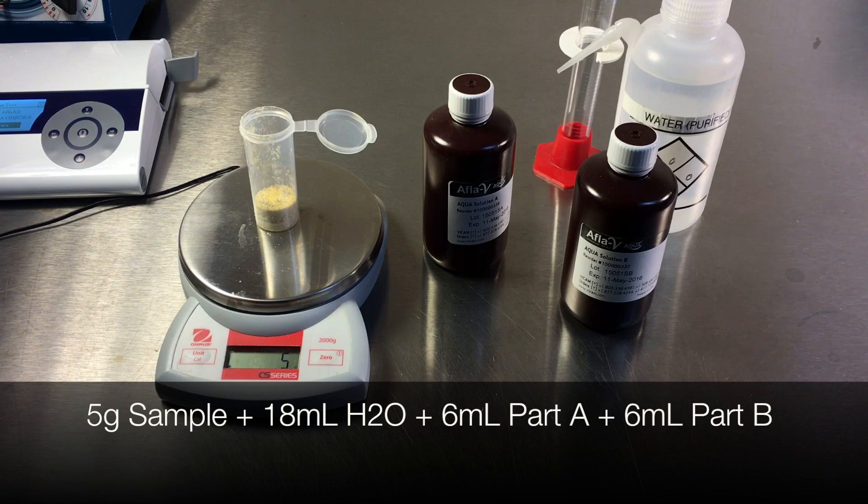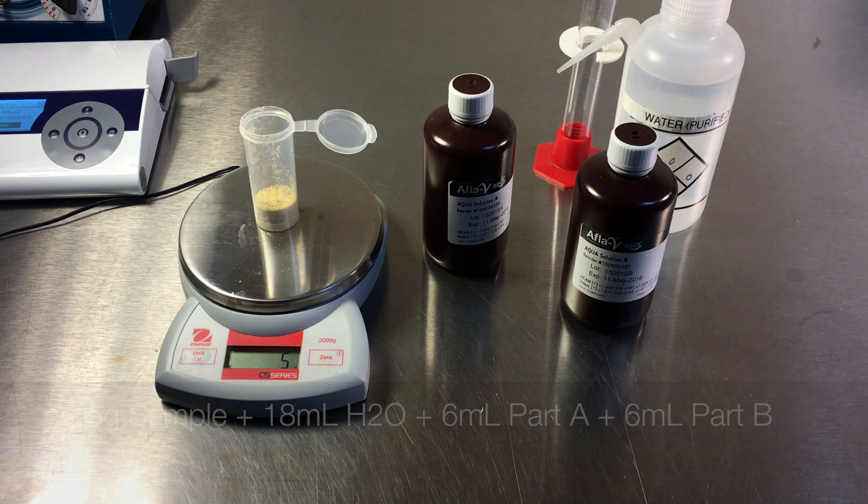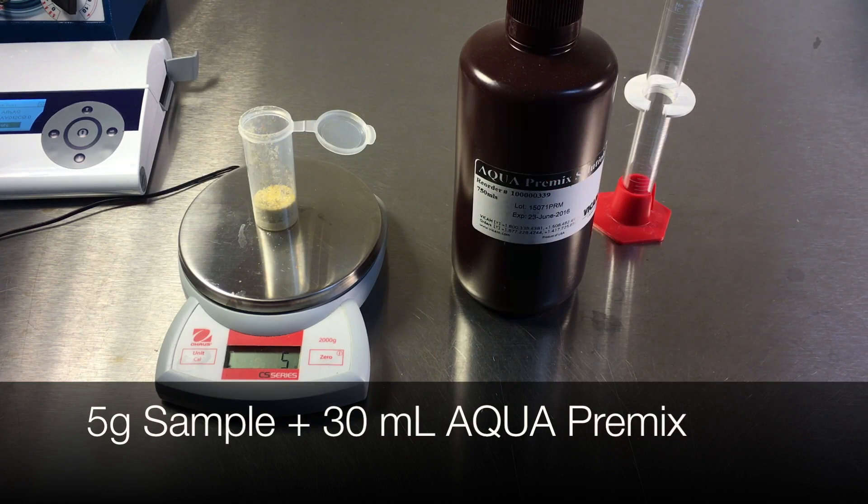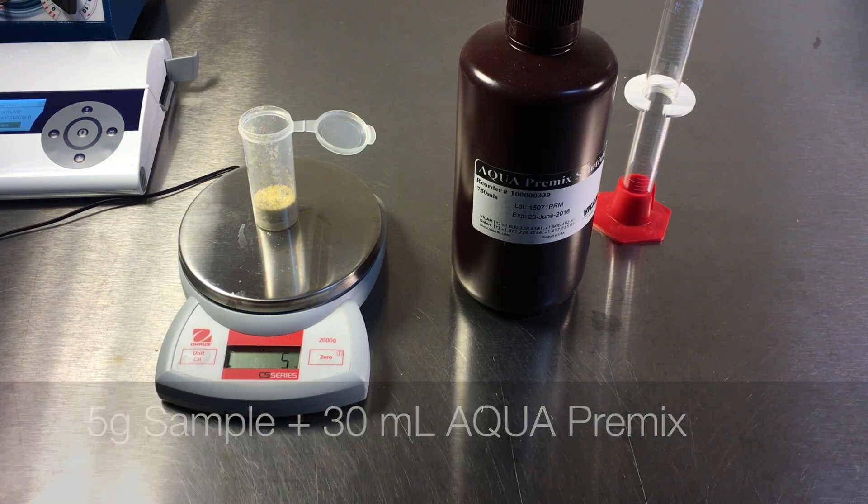Combine 5 grams of ground sample, 18 milliliters of purified water, 6 milliliters of aqua solution part A, and 6 milliliters of aqua solution part B. Alternatively, combine 5 grams of sample with 30 milliliters of aqua premix extraction solution.